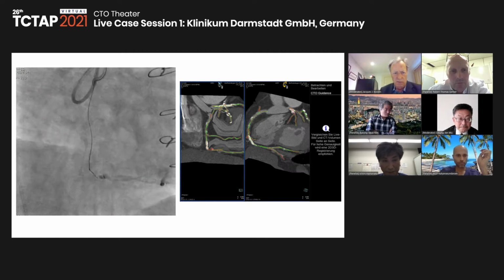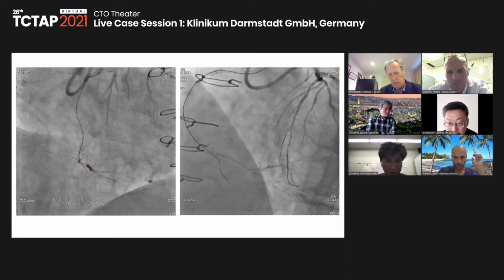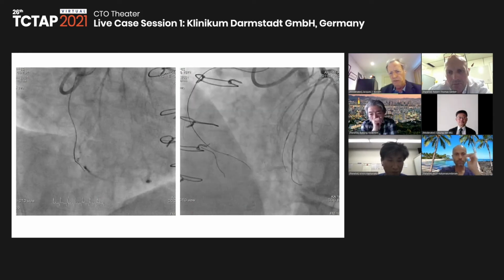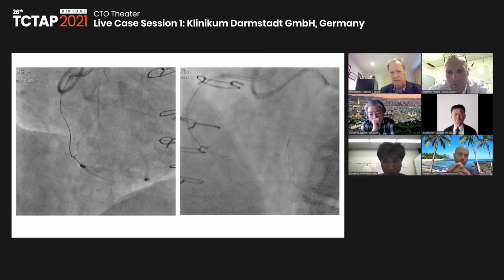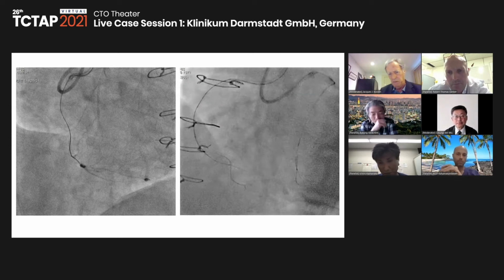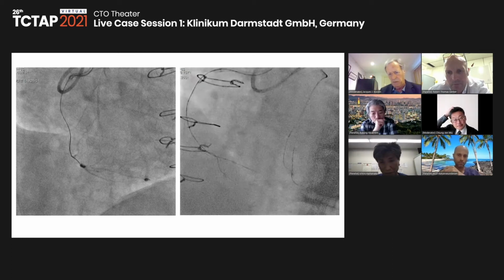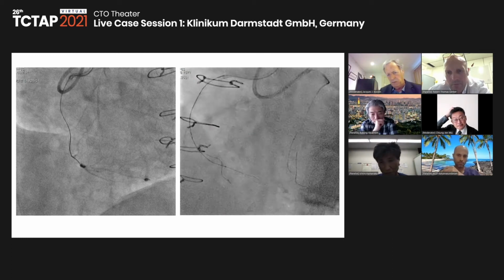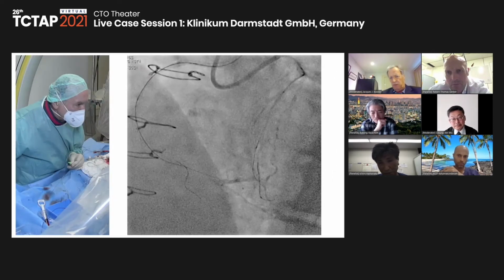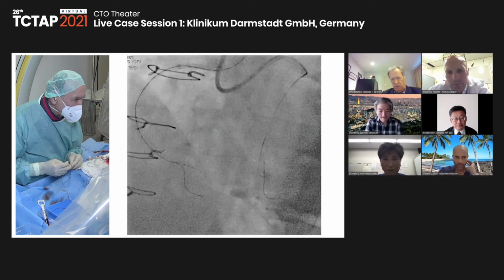Actually, we're very close. Yeah, on the A plane, you see that we are probably below. But it looks definitely a little bit better than before, actually. And we know that here it's actually very soft. So you see, I get a different course with my branch, with my Gaia. Yeah, it's way off. We're a little bit off.